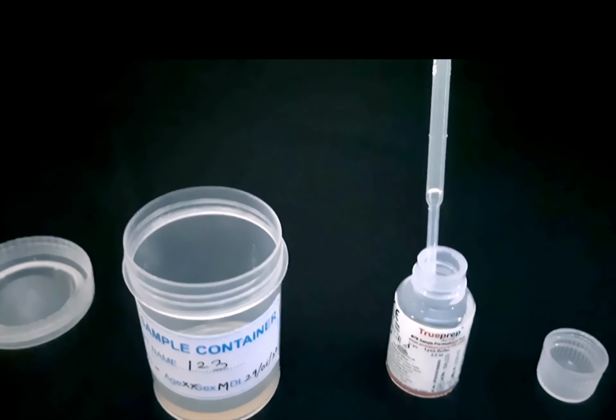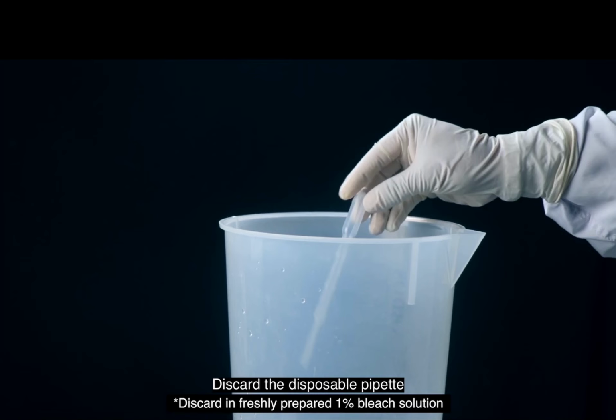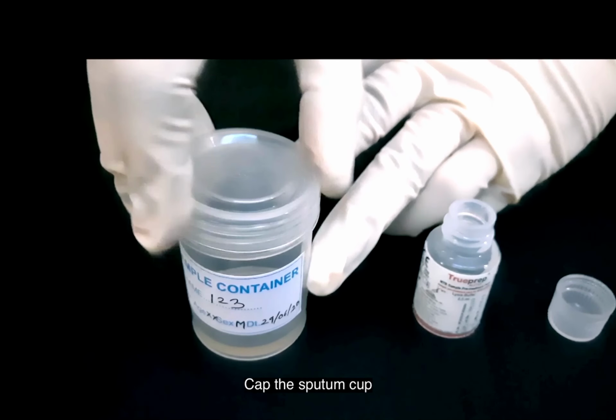Now you transfer it to the lysis buffer. And this pasteur pipette you discard in 1% hypochlorite solution. Now you close the sputum cup and keep the sample. See, now this liquefied sample is there. Never throw a sample till your result is confirmed. If you have any problem, contact your higher microbiologist or your TB lab supervisor, and confirm with them how to proceed with further steps. Never throw a sputum sample till the final result is entered.